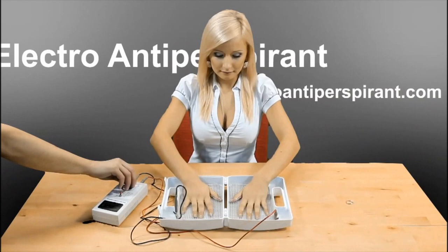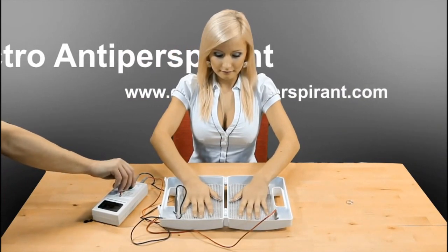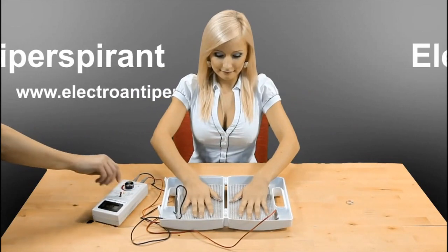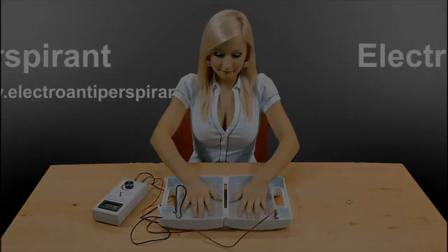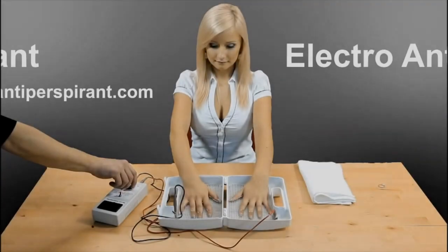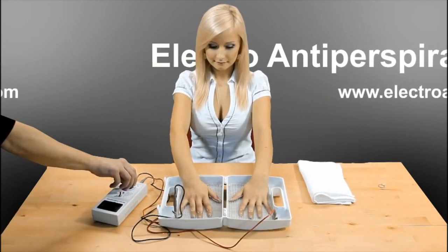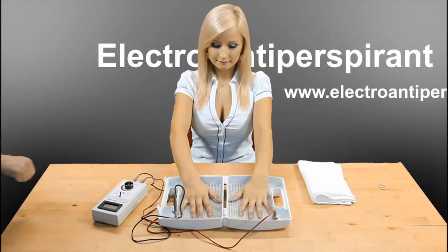After 12 minutes, slowly turn off the device and when the green LED is off, switch the device to position 2 and carry out the same procedure as for position 1. Once Electro Antiperspirant is completely off and the green LED has gone off, remove your hands out of the water and finish the therapy.